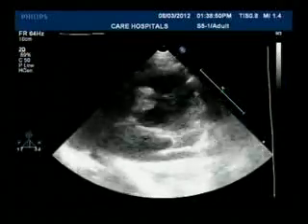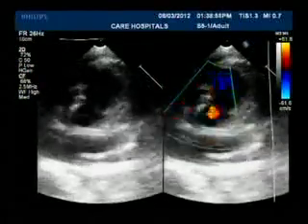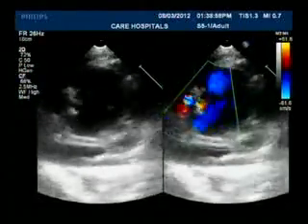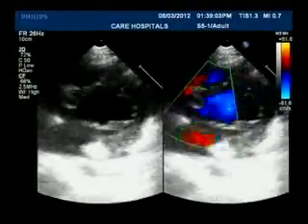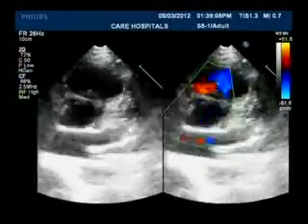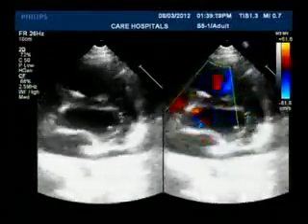So there it is, you can see the central disc and you can also see the proximal disc, which is on the LV side. And the central disc is supposed to seat on the tunnel-like VSD which you saw on the echo. I'm just readjusting the position.